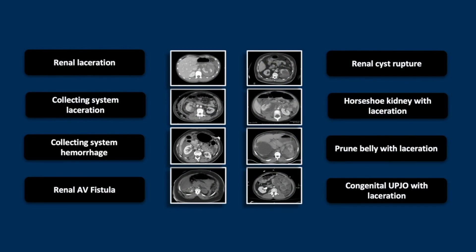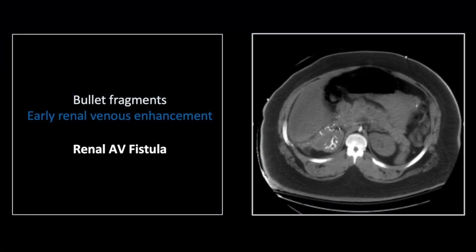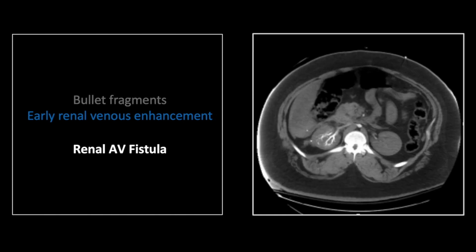Our next case is a renal arteriovenous fistula related to a gunshot wound, as so many of these injuries are. You can see small metallic bullet fragments lying along the tract of the bullet, which passes across the anterior aspect of the right kidney. You can also appreciate the right renal venous enhancement pattern present here, and compare that to the absence of any nephrogram in the left kidney. This is an early arterial phase scan, so it's the left kidney that is normal.